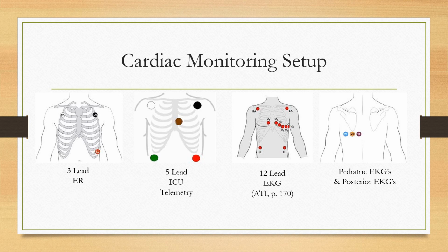And with telemetry, often patients are able to carry it with them. They're able to walk around if they're allowed to do that. Sometimes they're in the bed and they're on a monitor attached to the wall that then sends the monitoring to the nursing station, or they have what's called a telepack that they're carrying around, and the information is still being relayed to the nursing station. A 12-lead ECG is going to give us multiple views of the heart. That's all we're doing.